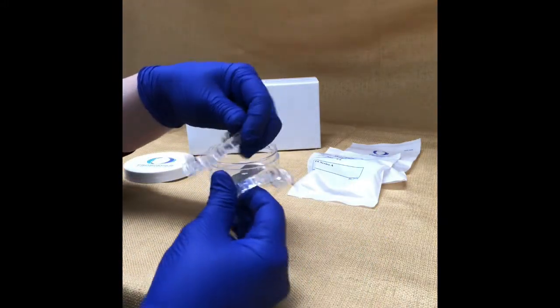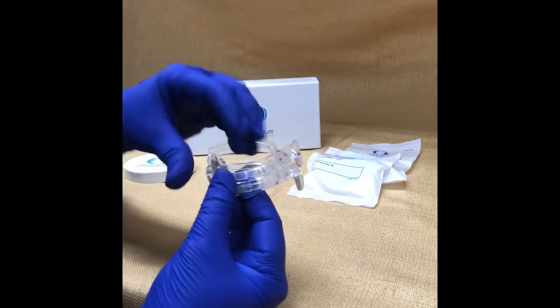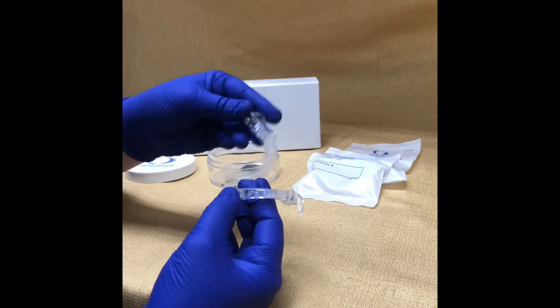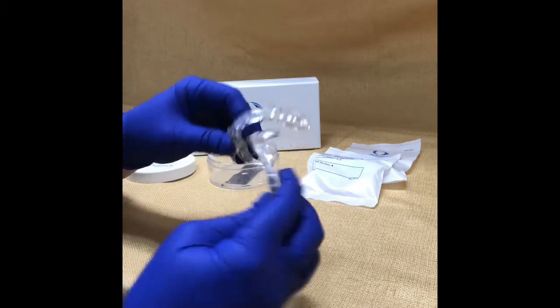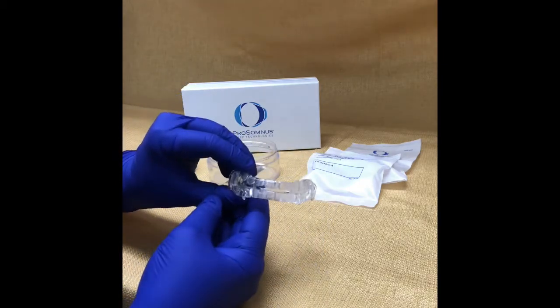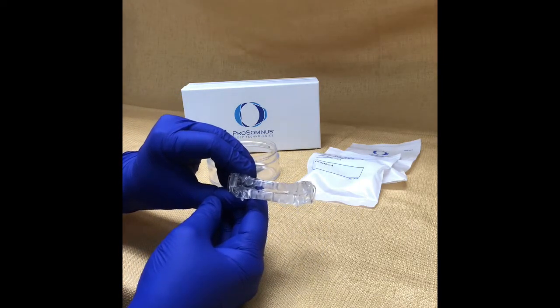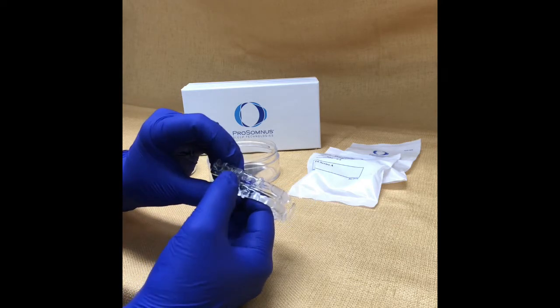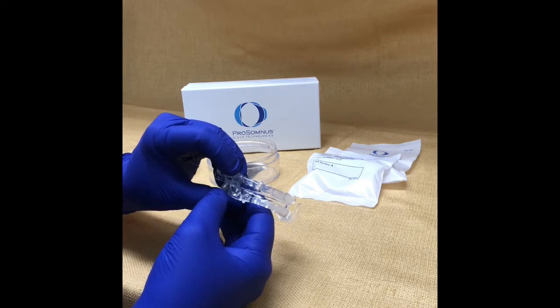If you just got started with your Prosomnus appliance, you're always going to start off with an upper zero and a lower zero. The next advancement you want to be making is in a combination of a number one — so one millimeter — meaning I want the U zero and L zero to equal one.